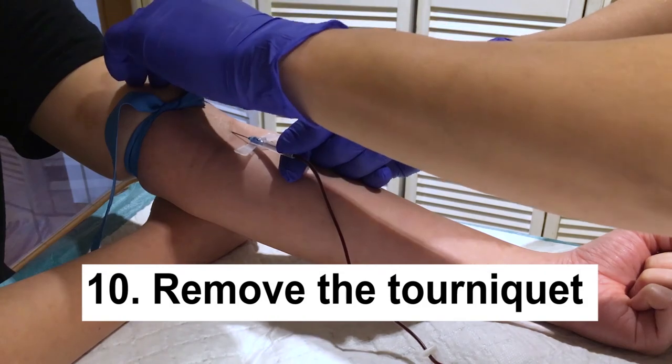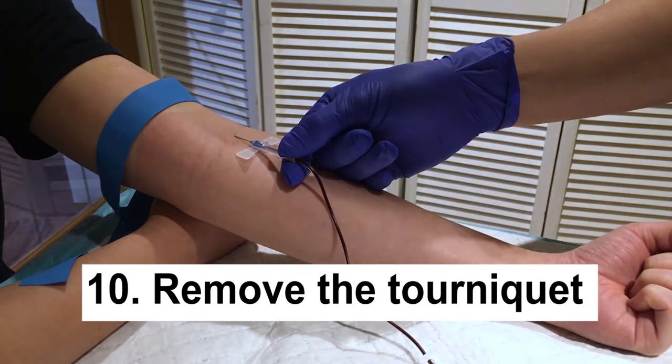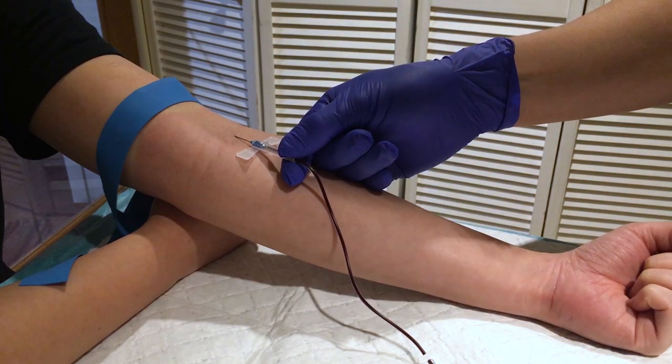Ten, as the blood is flowing, let the tourniquet go. Leaving the tourniquet on for too long will cause hemoconcentration and that will interfere with the test results.